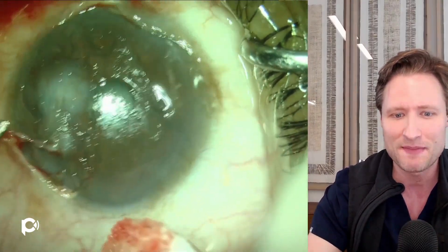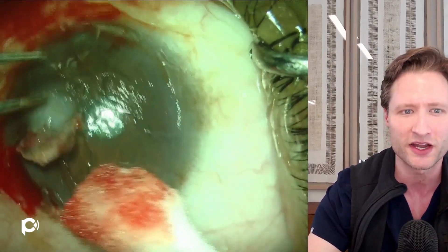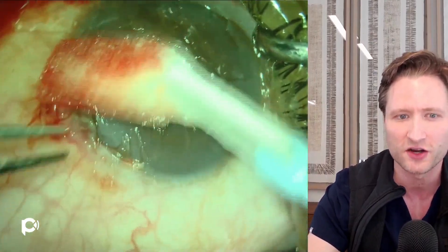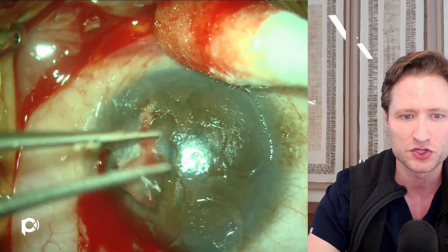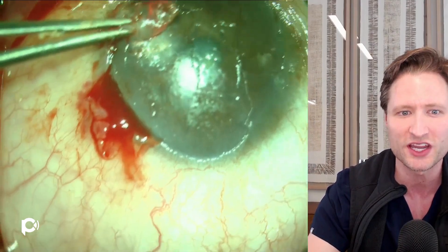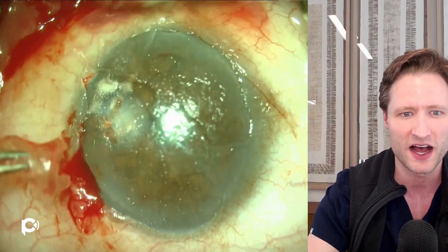Once I identify that plane, I'm able to pull this scar up with these tooth forceps. You can see what an enormous difference in the clarity and transparency of the cornea you make even before the endothelial procedures are done. This scar is tenaciously adherent to the underlying corneal stroma because there's been an inflammatory reaction brewing in this eye. But with careful, assiduous effort, I gradually manage to peel it free with tooth forceps coming from all sides, eventually yanking this bundle of scar off the surface of the eye.